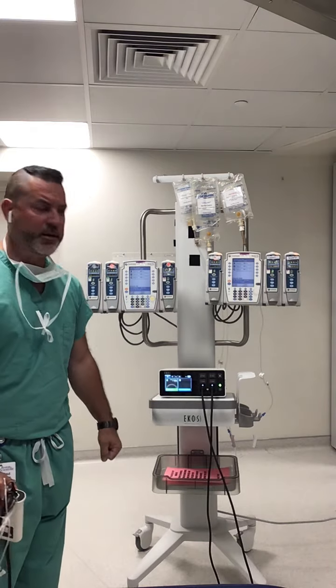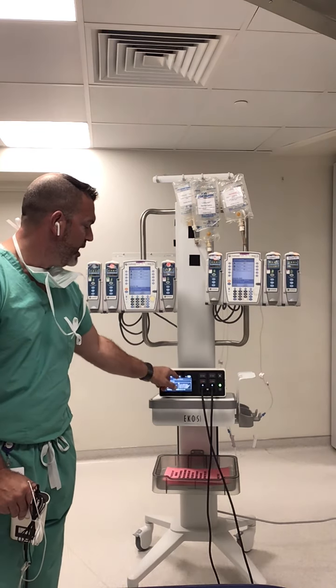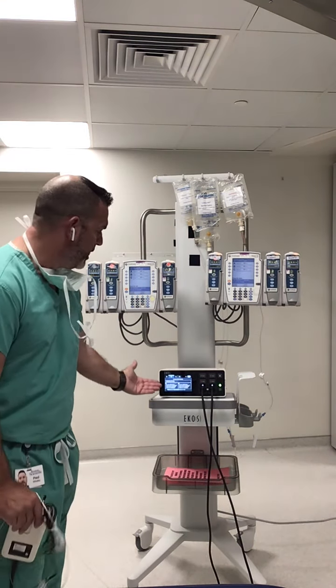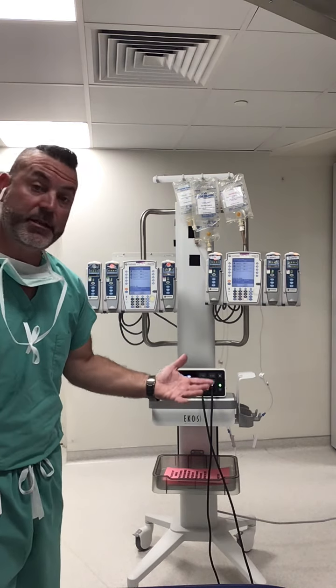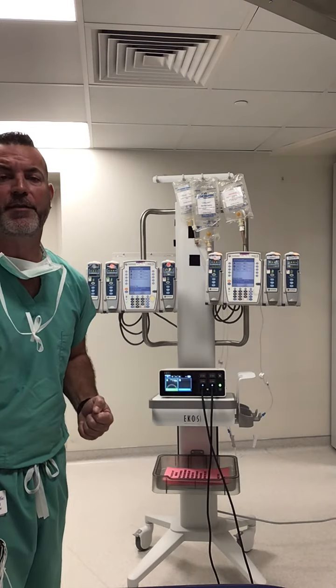Now, what's really great on our EKOS touch screen right here is that you have separate channels on the top, separate buttons that you can press to get you different information that you need. What I'm going to focus on are the two. The home button, I'm sorry I can't get any closer, is up here in the top left, and it's literally a house. It's a home button, okay? And that's going to show us the machine is running, or it's going to be telling you what you need to do to get your therapy started.